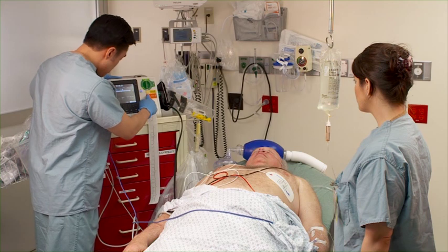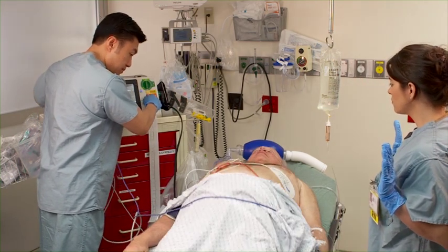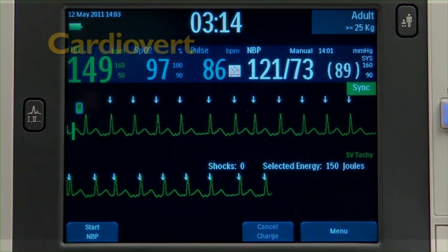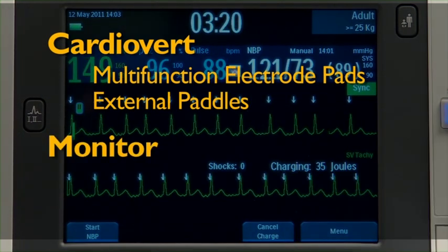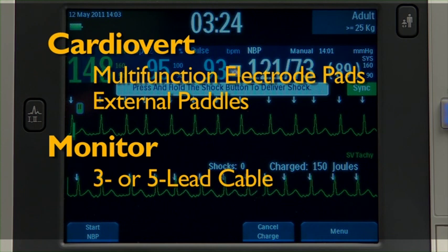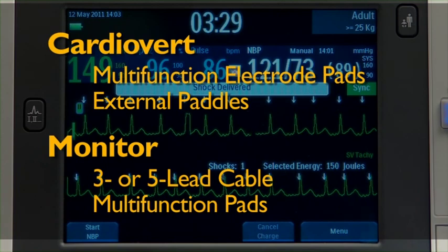With synchronized cardioversion, you deliver a shock synchronized to the R wave of the ECG being monitored. You can perform synchronized cardioversion through multifunction electrode pads or external paddles. You monitor the ECG through monitoring electrodes connected to a 3 or 5 lead ECG cable, or through multifunction pads with the energy delivered through the pads.